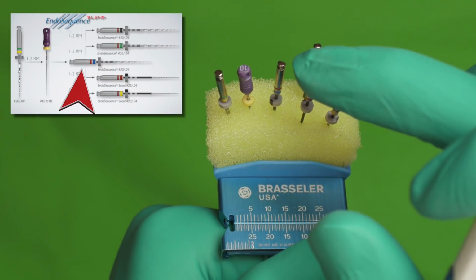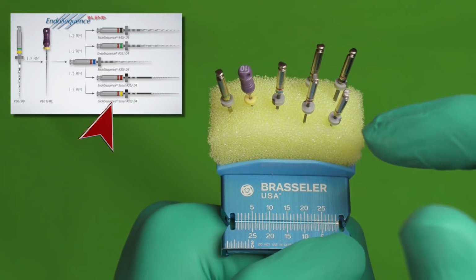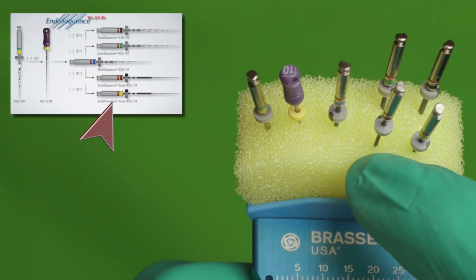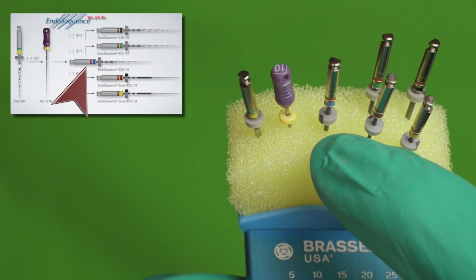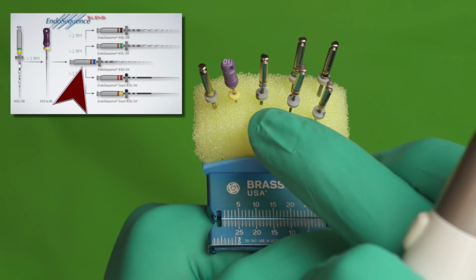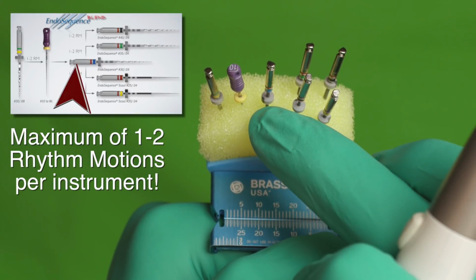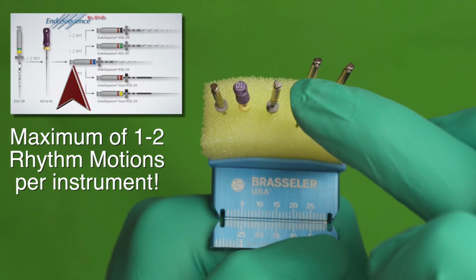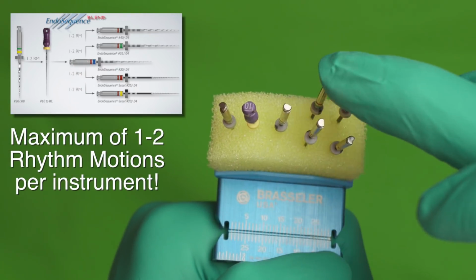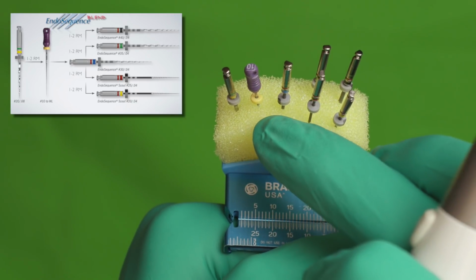And if it's a small canal, then you're going to move down in sizes with the EndoSequence scouts that are heat treated. The way you determine whether your canal is large or small is based on how the size 30 EndoSequence is advancing in the canal after 1 to 2 rhythm motions. If the instrument is down to the apex within 1 to 2 rhythm motions, you have a large canal and follow the protocol in the large direction, which is go to a 35 and 40 as needed. You finish basically when you have clean dentinal chips.